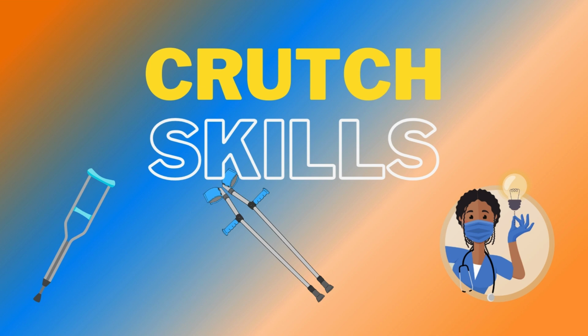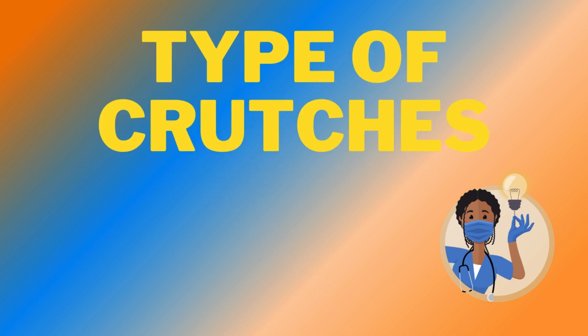Today, we're diving into a crucial topic for both nursing students and patients, crutch skills. Proper use of crutches can make a significant difference in patient recovery and mobility. Let's get started. There are three main types of crutches.